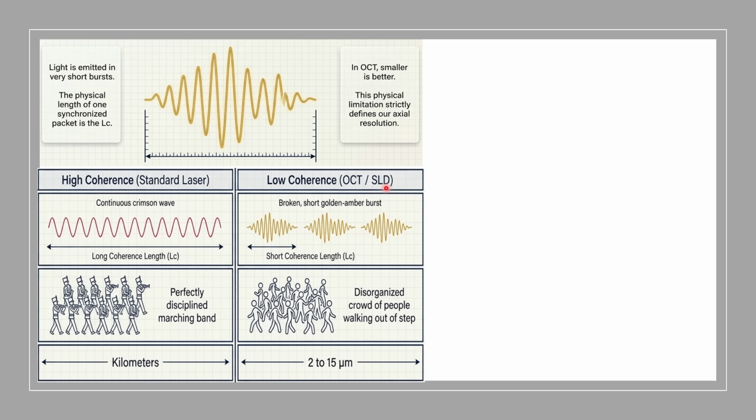That's low coherence. What's meant by low coherence? That small burst or packet of pulse will propagate synchronized for a short distance and then will decay. Now this distance is called the coherence length. This is the ruler that we use to compare one machine with another machine, based on this coherence length. So this is a small burst or packet of light.